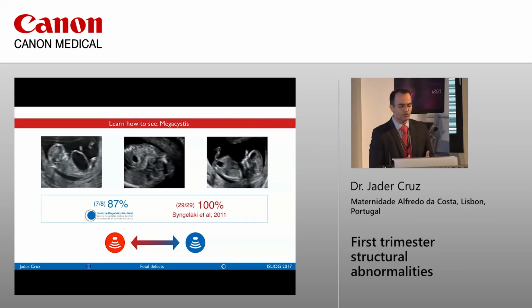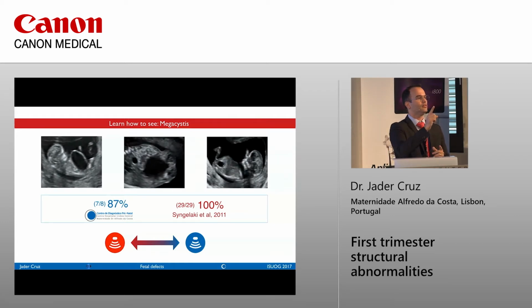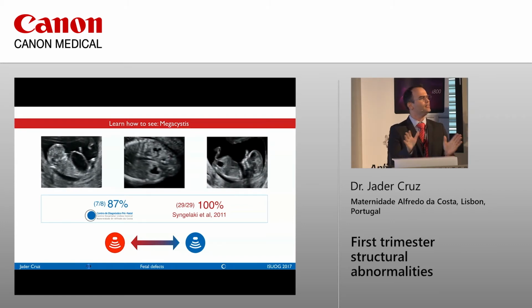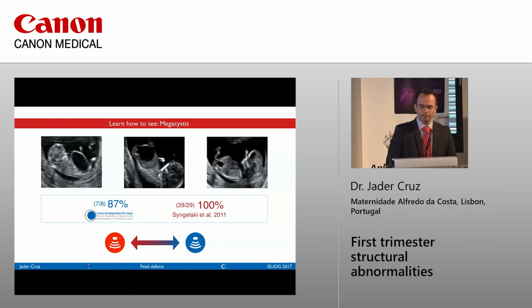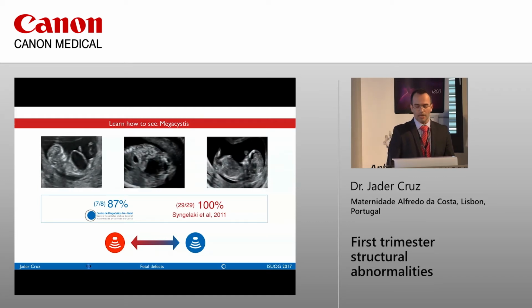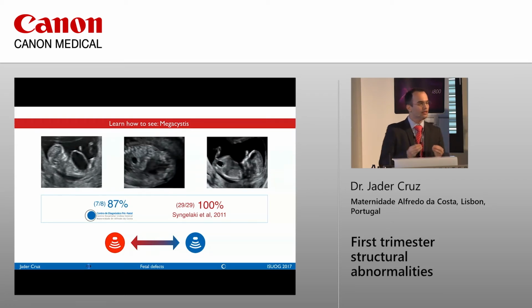So the person who looked at the baby, yes? Transabdominal. We do that, 98%, I will show you the data a little bit more. 98% of the time we do it transabdominally. Okay. And then by measuring that, you can actually detect better. So that's what happened. We were eyeballing that. Someone who did that thought it was a normal size bladder and didn't measure, so we missed this one. So that's important, learn how to see the abnormality.